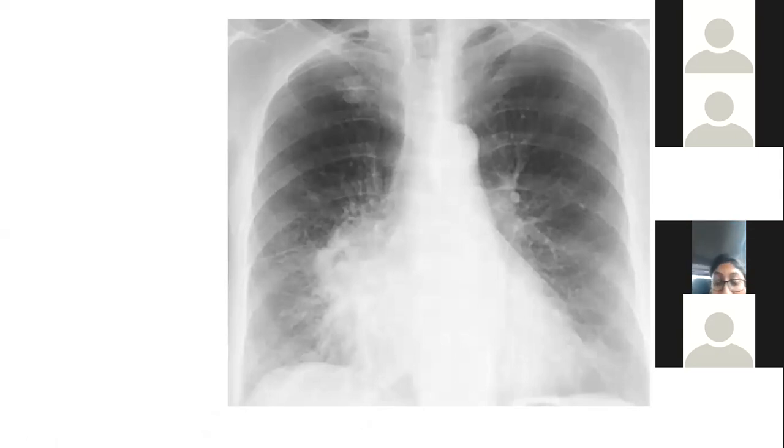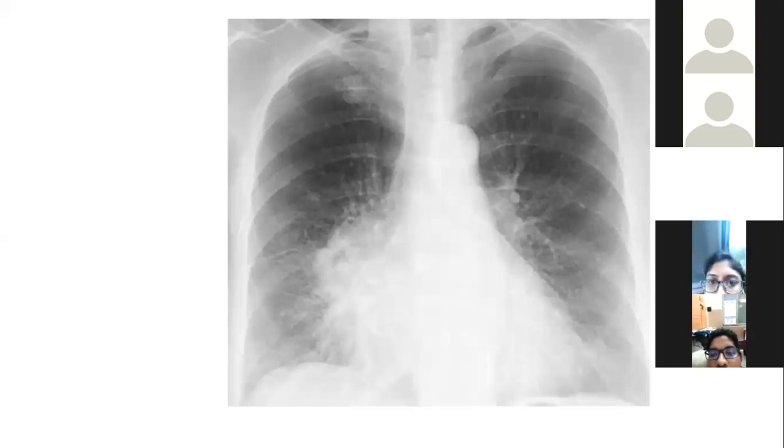So where is the lesion? Is there any abnormality? If so, where is the lesion?